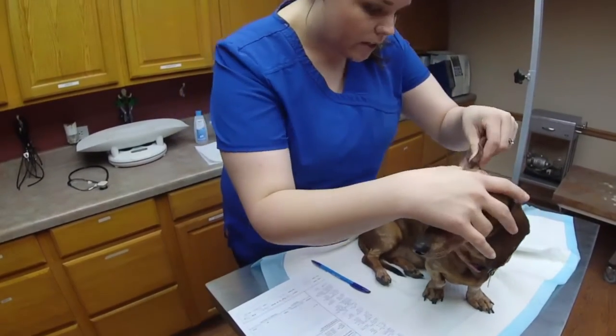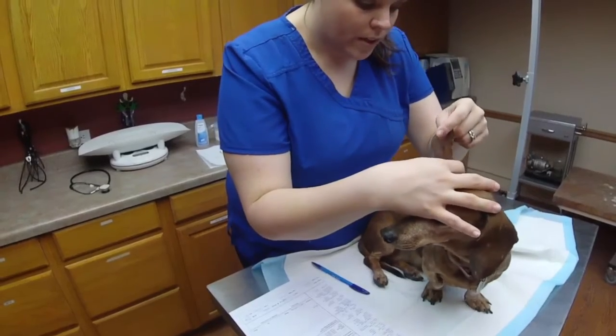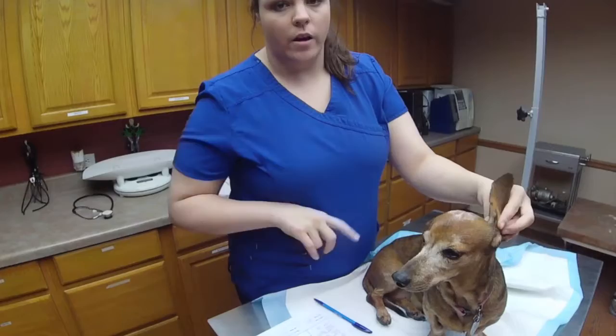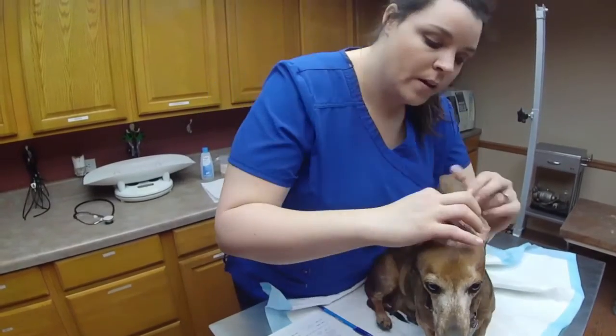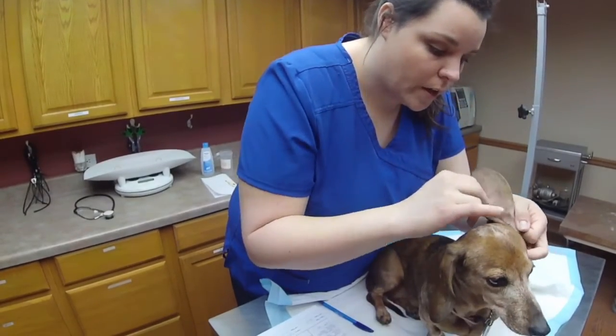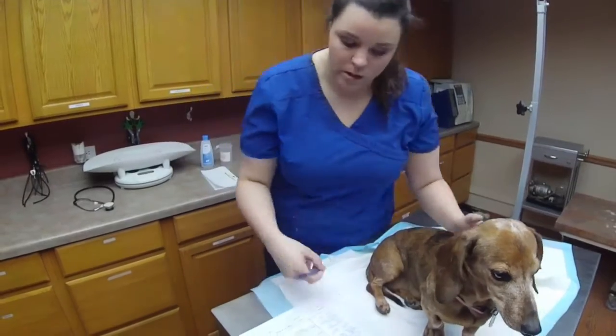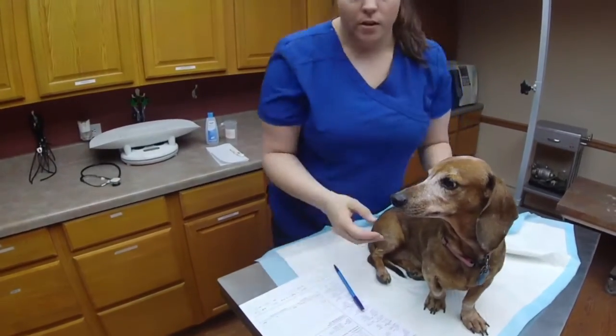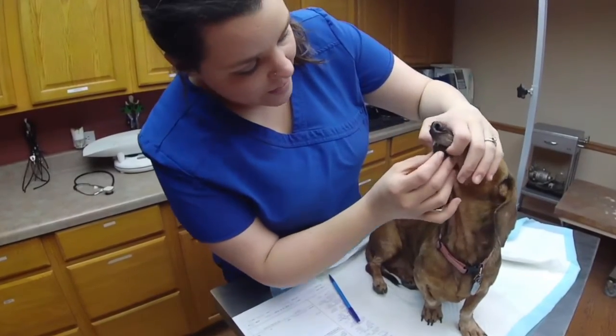We'll check her ears. If they are really dirty and infected or really red, you want to get your otoscope and check down in there. But her ears look perfectly normal. There's not even any dirt in there. So you'll want to check her nose and her throat.